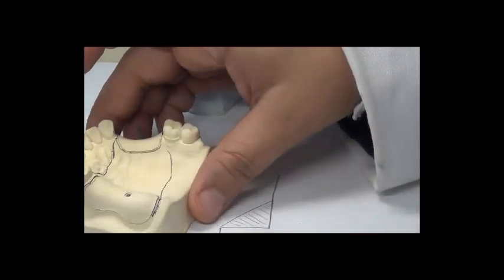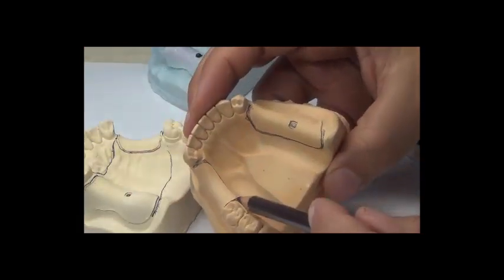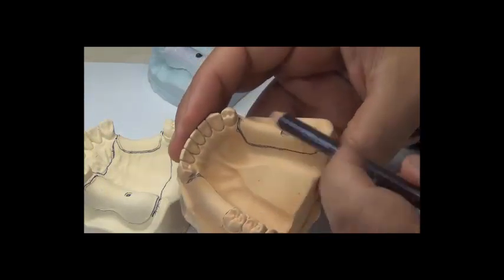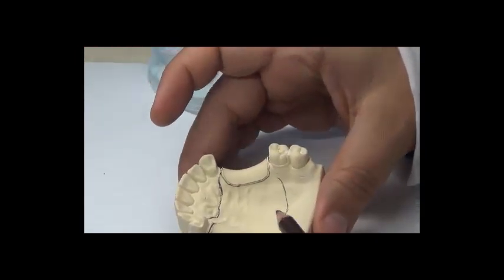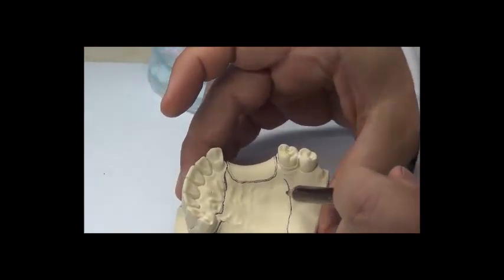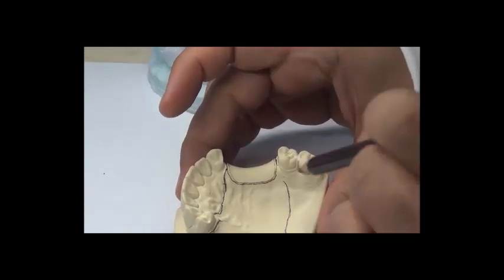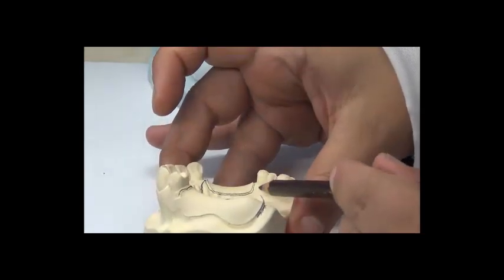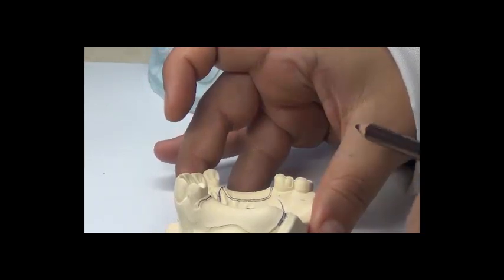For the lower, we don't have beading lines, so we're going to concentrate proximally, lingually, and then the other proximal side around the gauged relief, and as well we're filling in the boxes. For the beading line, we are extending our wax inside the beading line. We want to make sure that we have wax inside the beading line. And remember that the beading line does not touch the tooth. It's free from the marginal gingiva by around 5 to 6 millimeters. Beading lines do not extend to abutment teeth.